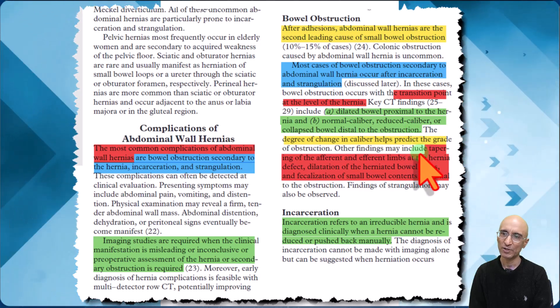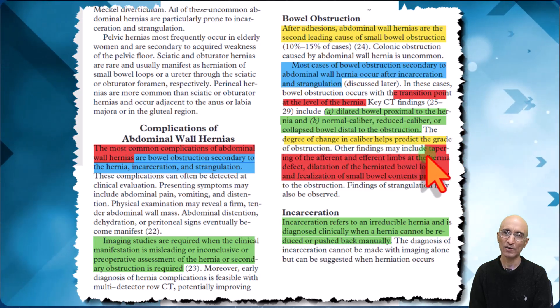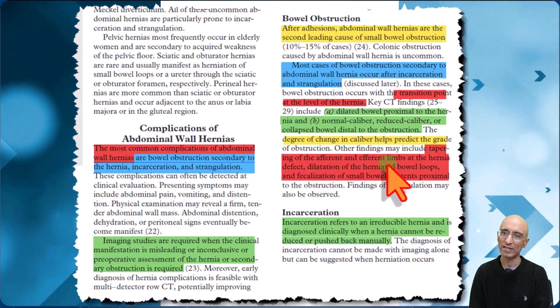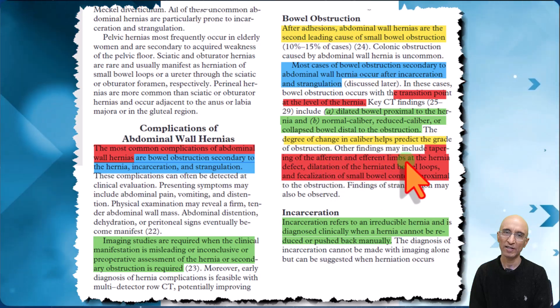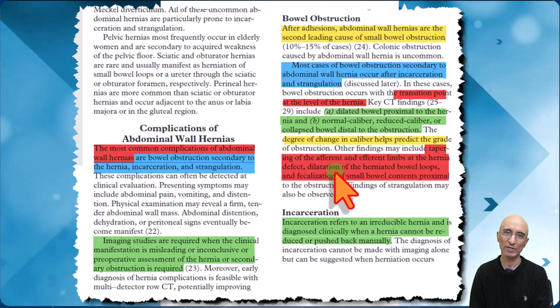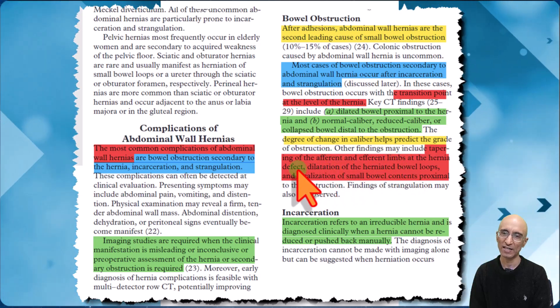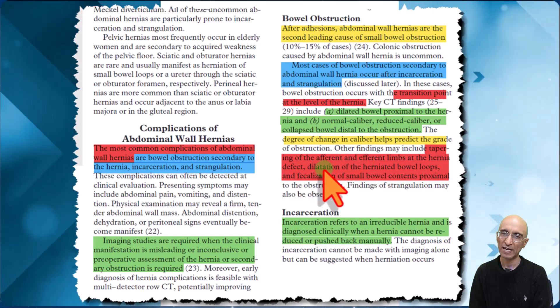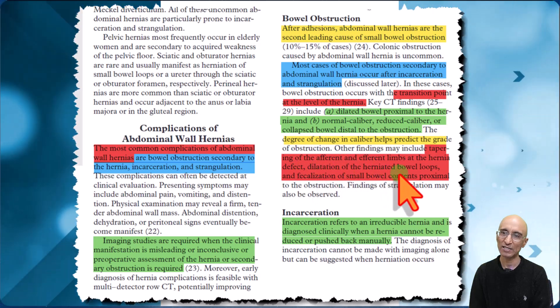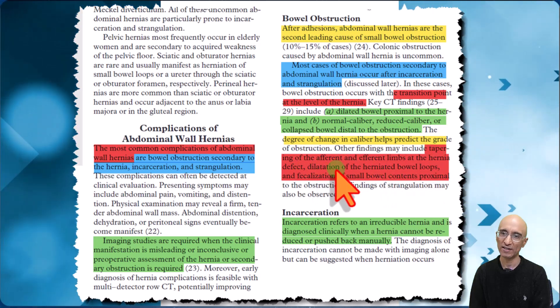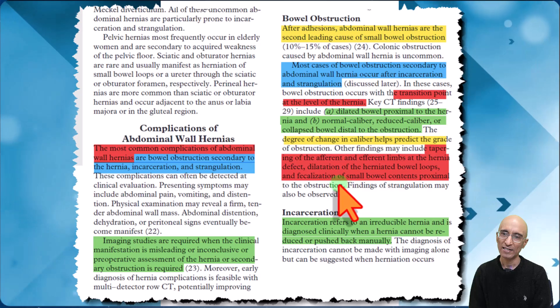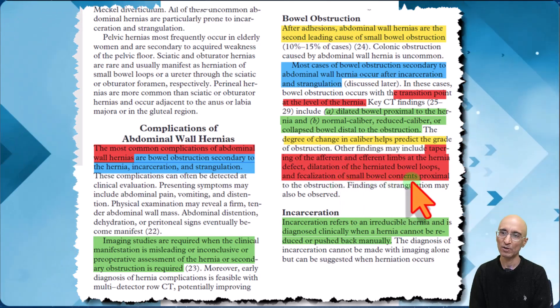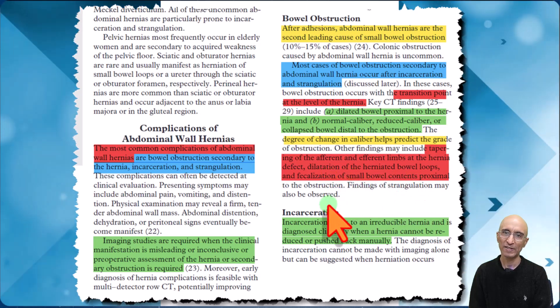Other findings on CT would include tapering of the afferent and efferent limbs of the hernia at the level of the hernia defect, as we saw in our patient. Additionally, though not seen in our patient, there can be dilated loops within the hernia sac and fecalization of the small bowel loops proximal to the hernia.